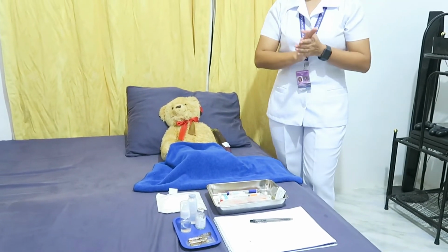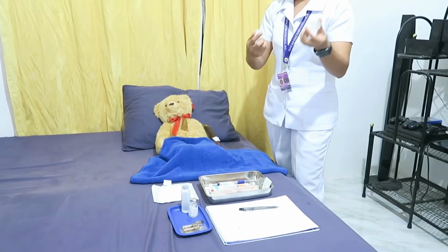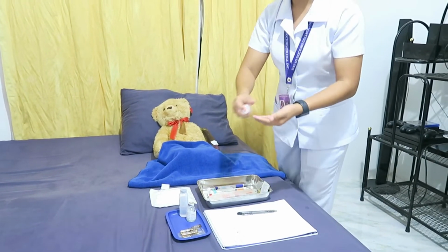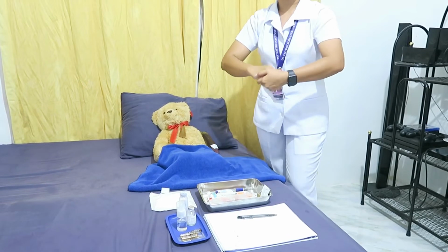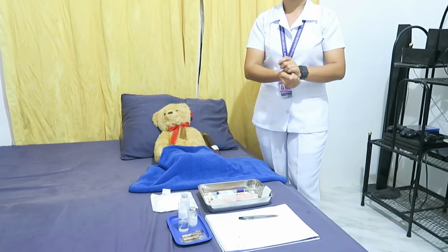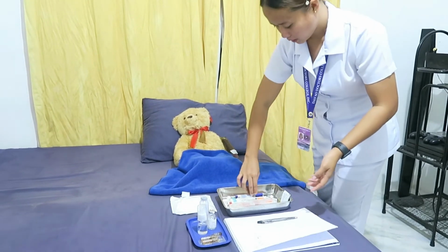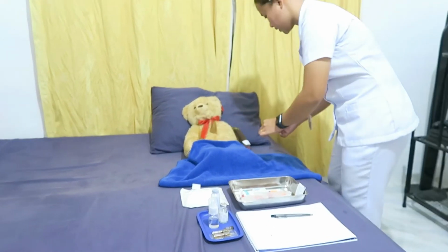After we perform the hand hygiene, the next step is to circle the injection site with ink to observe for redness or induration, or the hardening, per agency policy. So let's draw the site.